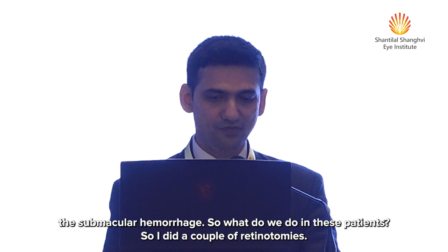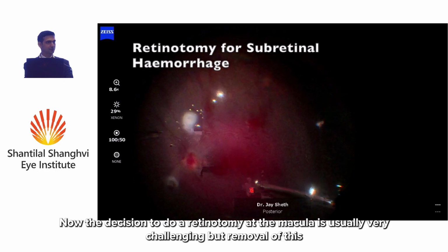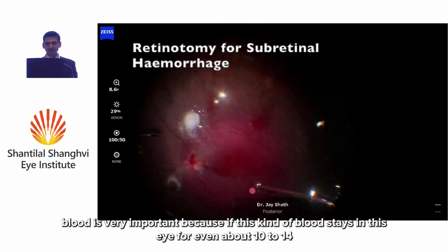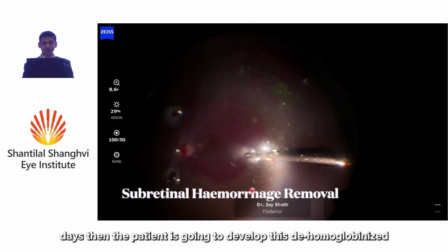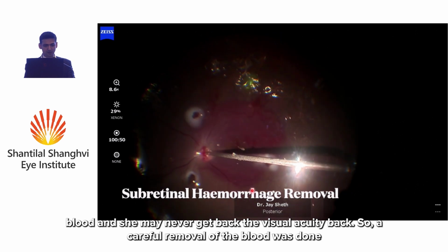I did a couple of retinotomies. The decision to do a retinotomy at the macula is usually very challenging, but removal of this blood is very important, because if this kind of blood stays in the eye for even about 10 to 14 days, the patient is going to develop dehemoglobinized blood, and she may never get the visual acuity back.